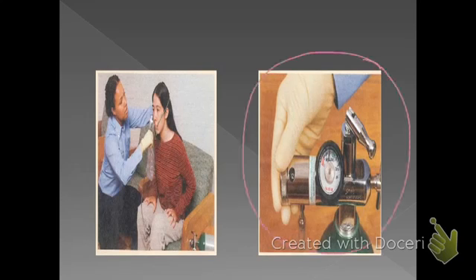and then last but not least, we just want to confirm again that our liters per minute are appropriately set for the particular delivery device. Since this is a non-rebreather mask, we're looking at about 10 to 15 liters per minute. So it looks like we're within normative values here.